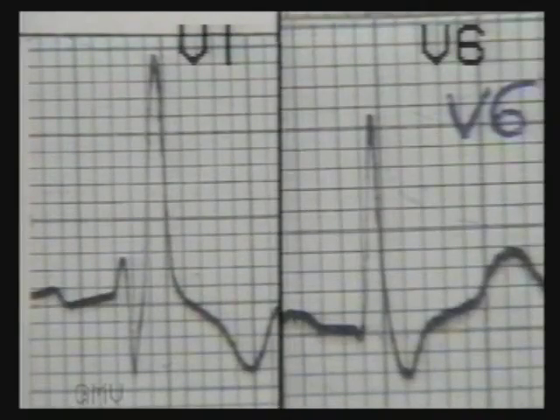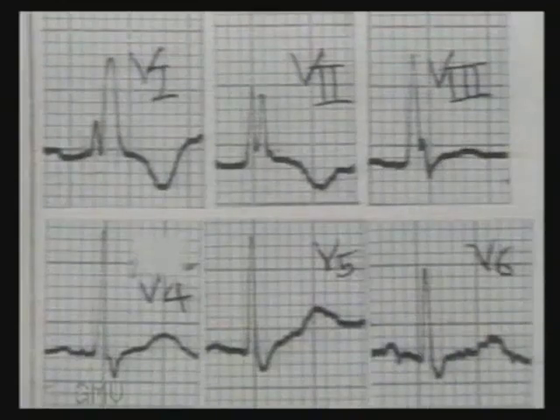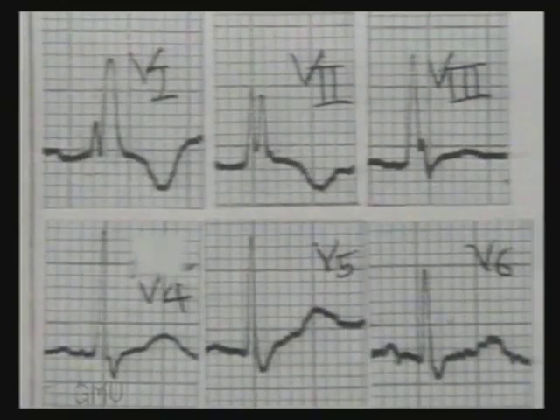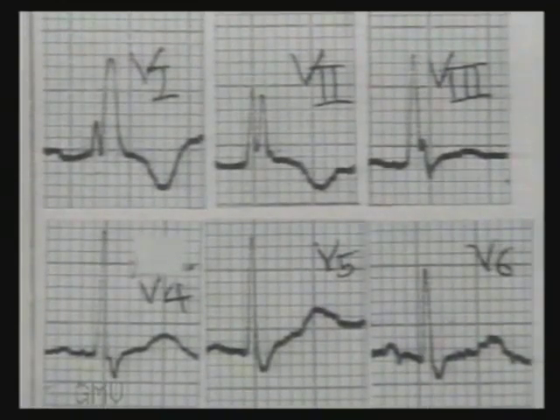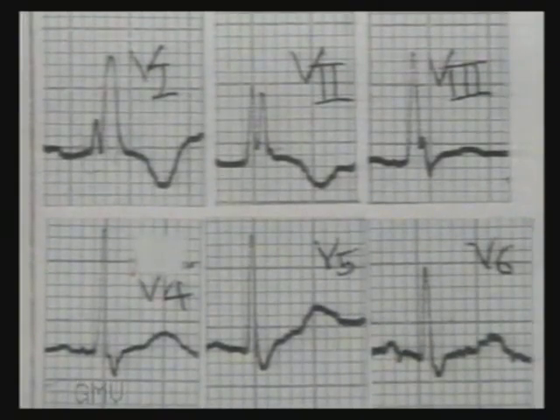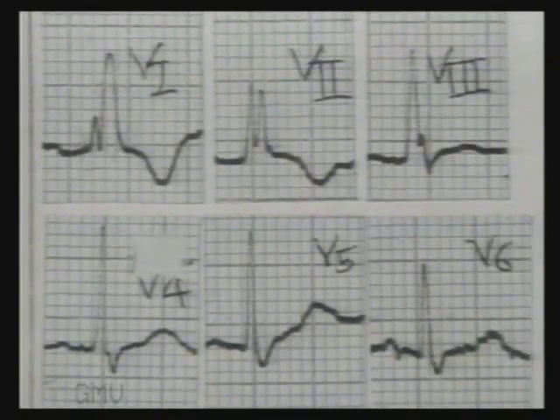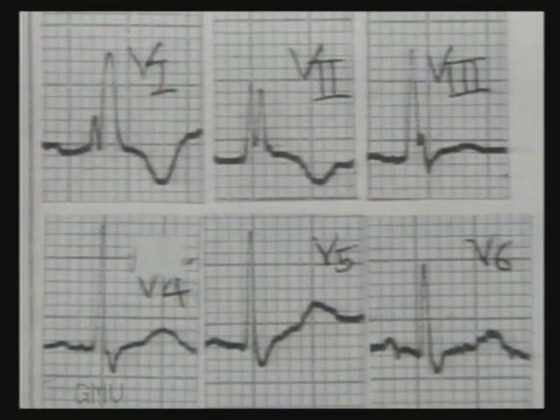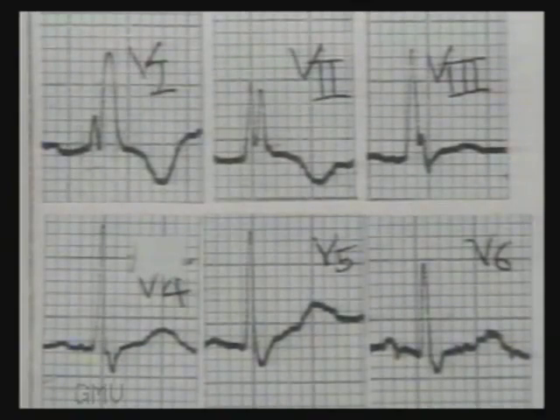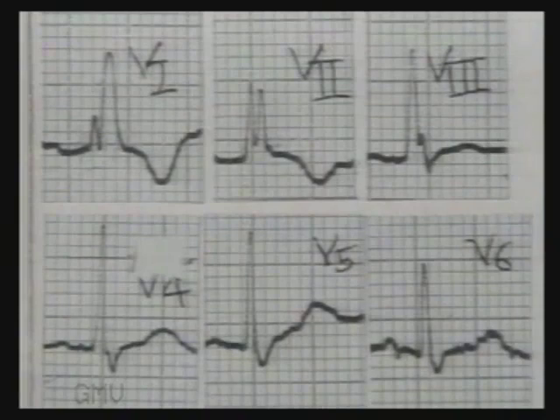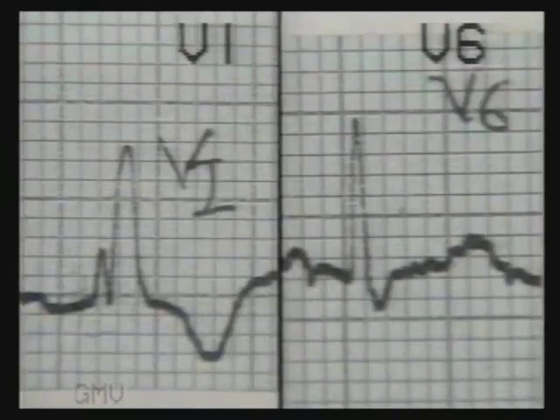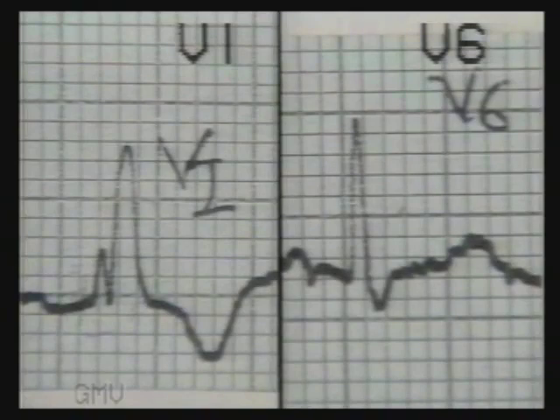Note again the rabbit ears in V1 and wide S-wave in V6. This is another ECG of right bundle branch block. Note the RSR' pattern in V1, typical rabbit ears in V2, and shallow but wide S-wave in V5 and V6. In close-up view, RSR' in V1 and wide S-wave in V6.